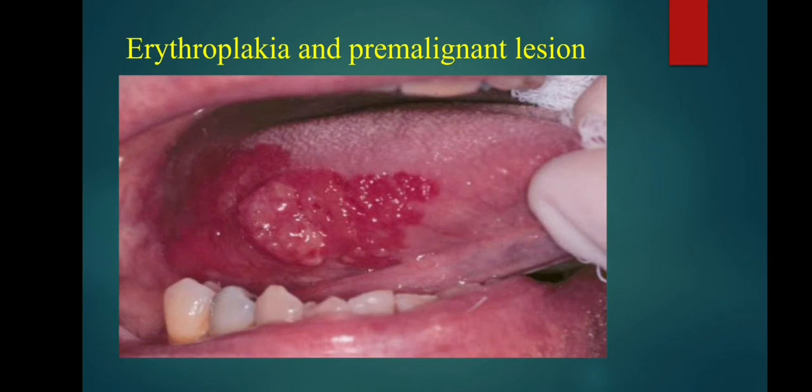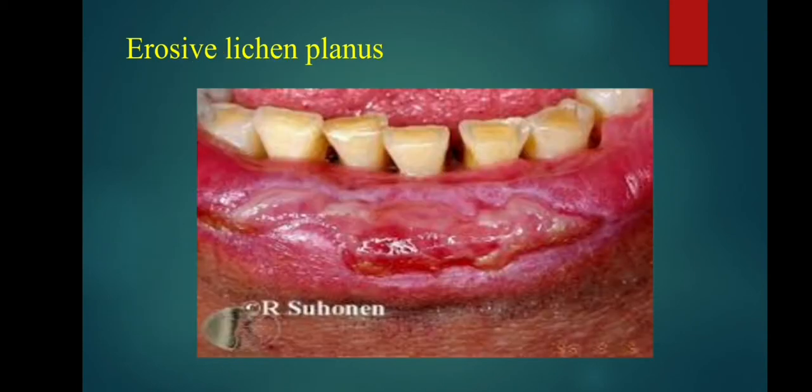Erythroplakia and pre-malignant leukoplakia. Mildly dysplastic superficial lesions can be treated by ablation. Severely dysplastic lesions need a deeper excision, and it is then advisable to use the laser as a knife so that the whole lesion can be sent for histopathology. Erosive lichen planus that doesn't respond to any other treatment is occasionally treated by laser with some success, but this is best considered as a last resort kept for patients with severe symptoms.